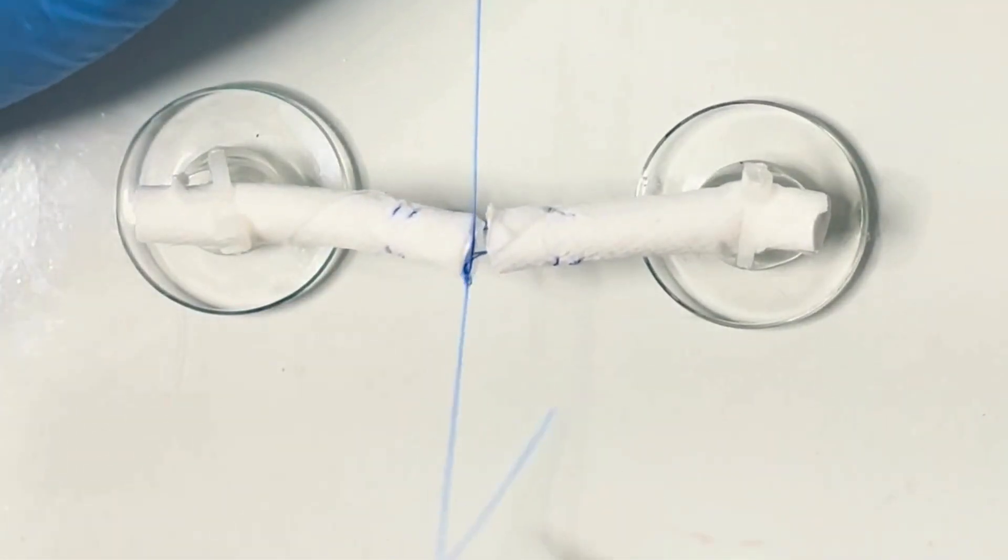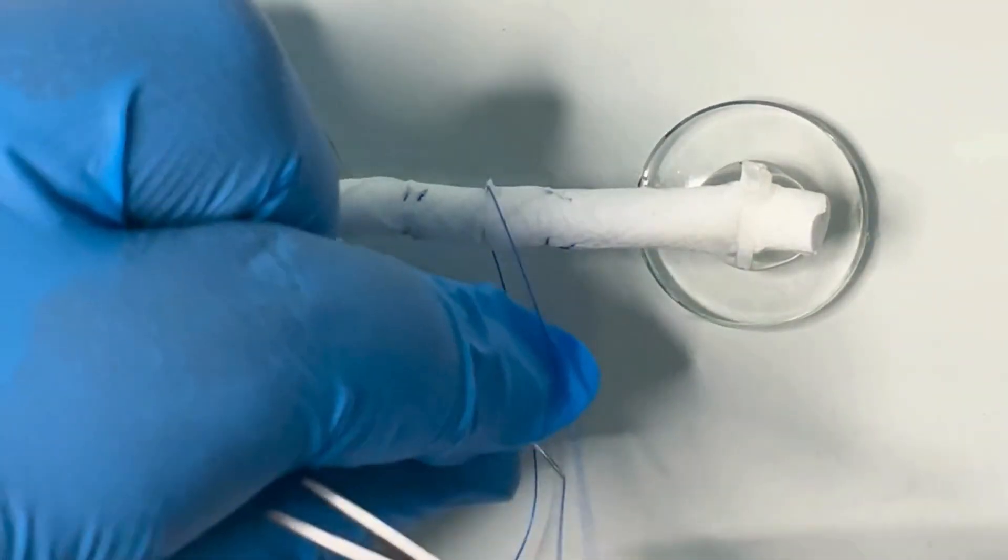Tie your knots in parallel to the cut at 90 degrees to the tendon direction.